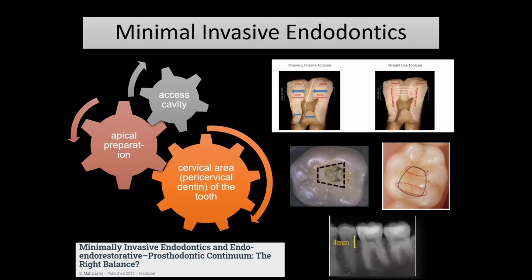Now, the traditional endodontic access emphasizes straight line access into the root canal, as seen over here. The major concern related to this type of preparation is the amount of tooth structure that is removed, which may reduce the tooth's resistance to fracture. In order to overcome this limitation, David Clark and John Khademi came up with a new design known as conservative endodontic access cavity, also known as ninja access or truss access, in order to minimize the tooth structure removal.